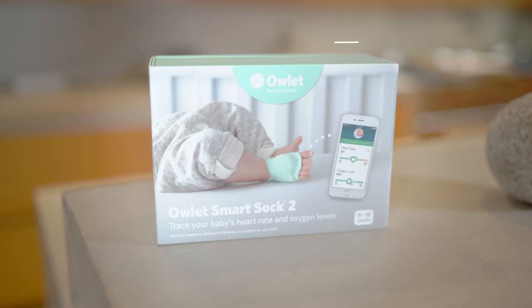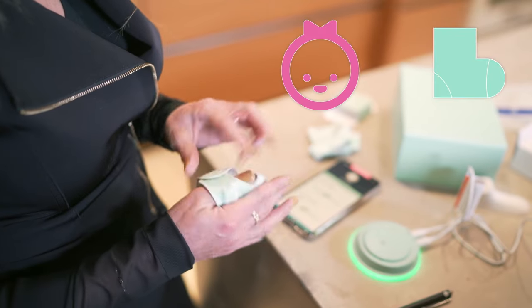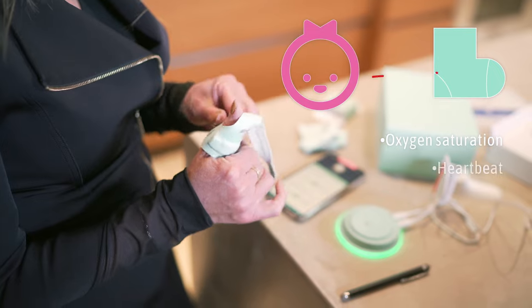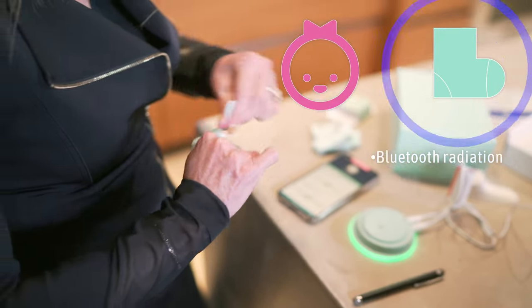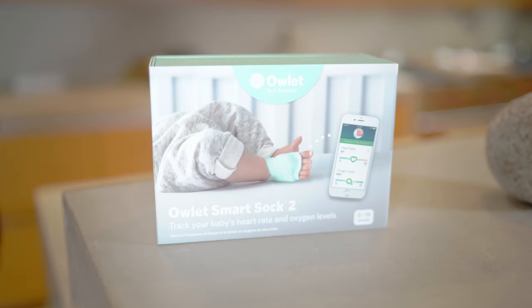This is the Owlet baby monitor — your baby's health and well-being at a glance. Now this is kind of confusing because it says it's powered by clinically proven technology, which some people might read as safe. What it's saying is that the pulse oximetry technology used in the sock to measure baby's oxygen saturation and heartbeat is clinically proven. It is not saying that the Bluetooth radiation coming from the sock is clinically proven to be safe.